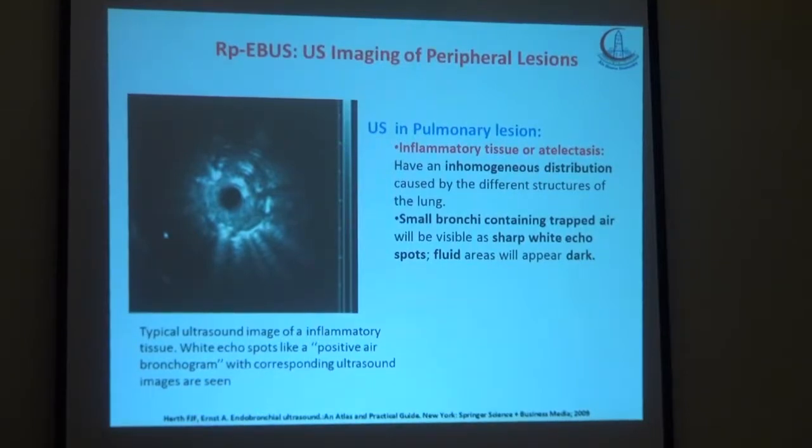بس بعض الاحيان لو في حتت نكروتك وحصل بريكنج داون، فتلاقي حتت سودا في النص كمان. لكن بالبلدي كده هتلاقي حتت سودا وفي زي ريدج حواليها ابيض، يبقى ده في تيومر، حتت منقطه وفي حتت فيها هيتروجينيستي يبقى انفلاماتري، وفي حتت سودا صغيره فيها يبقى دي فيها اريا اوف انتروس.